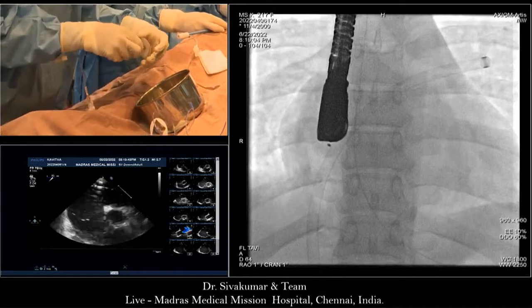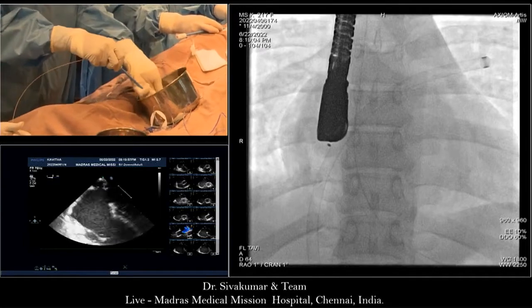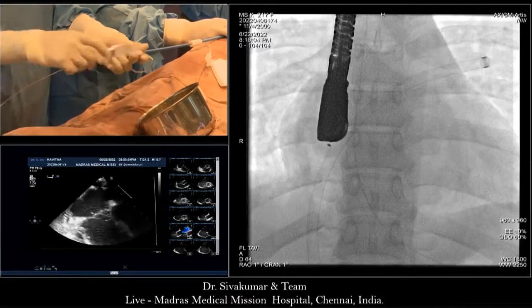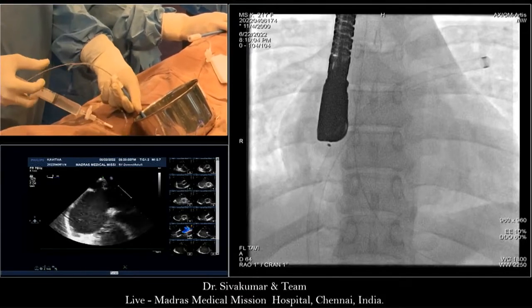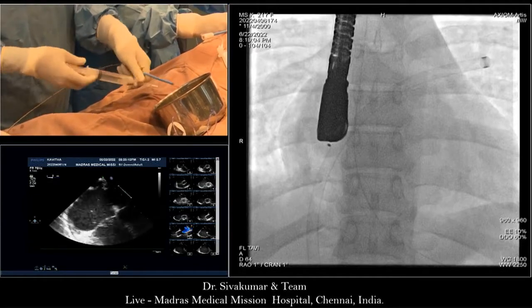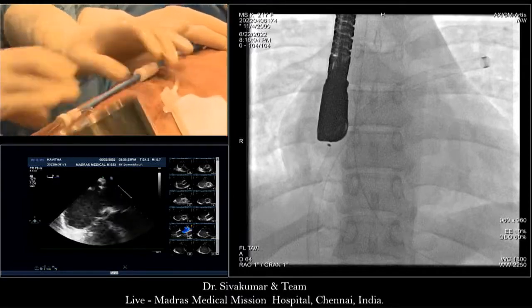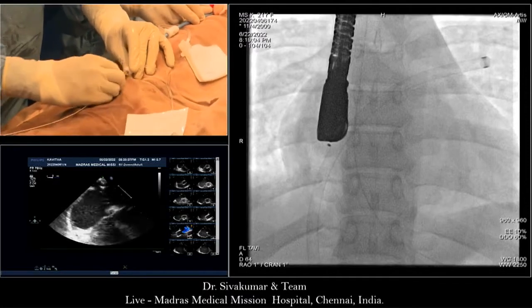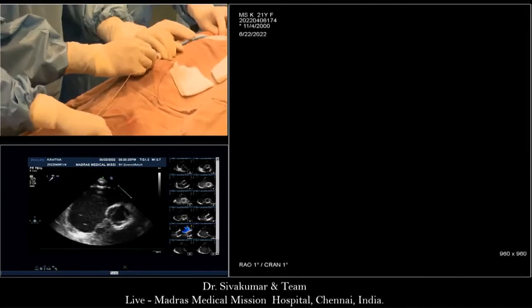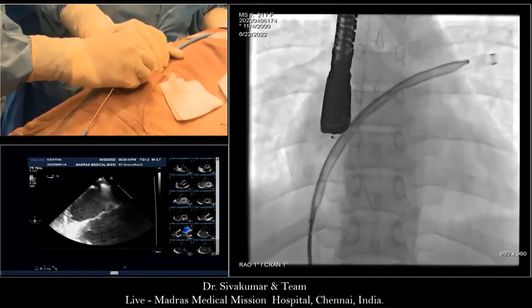Okay. Is there any recommendation for using softer devices for the deficient rims? I mean, soft is always great, right? There's no question about it. We can never fight that. But if size, there is a reason Occlutech and Amplatzer come in 1 millimeter increments from 4 to 20, and then 2 millimeter from 22 to 38 or 40 millimeters. There is a reason. Amplatzer wasn't crazy to make 23 different sizes. The reason is if you have a self-centering device, you should size it. Don't undersize it. Don't oversize it. I've done 2,200 Amplatzer cases. I have never had it. So if you look at the incidence, I should have had 6-7 cases of it. So size it, don't oversize it, that's the whole premise. And the device behaves differently, a softer device and a so-called rigid device.